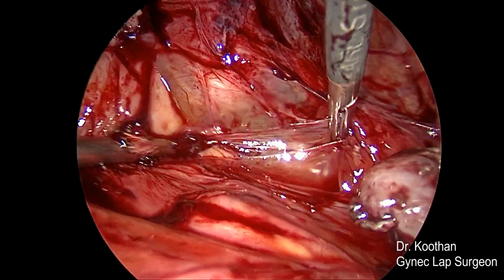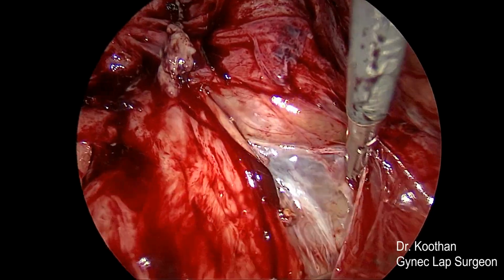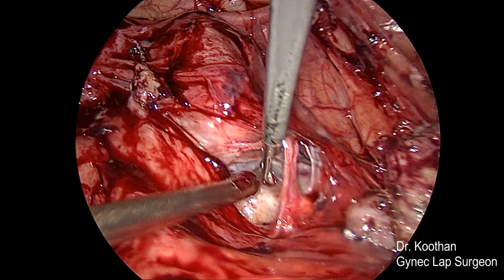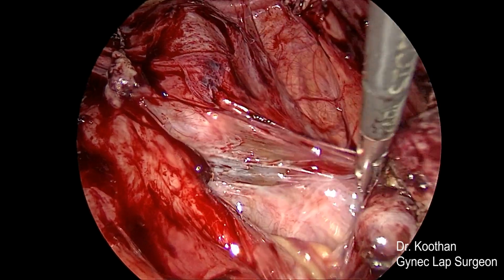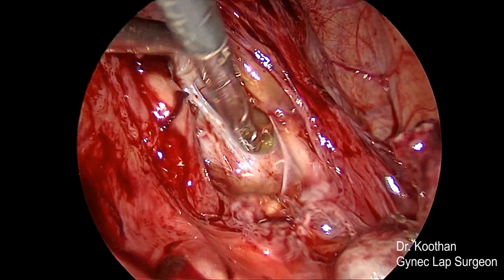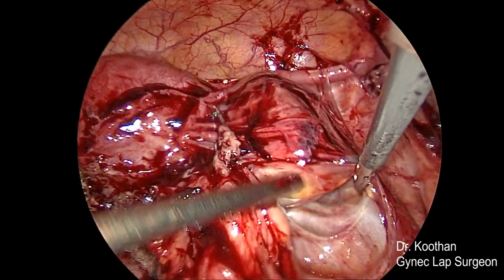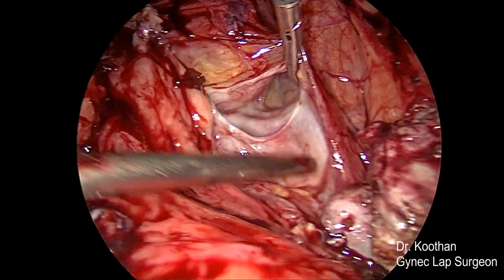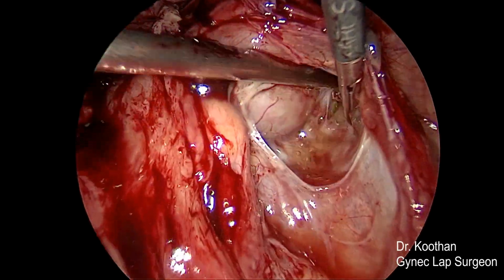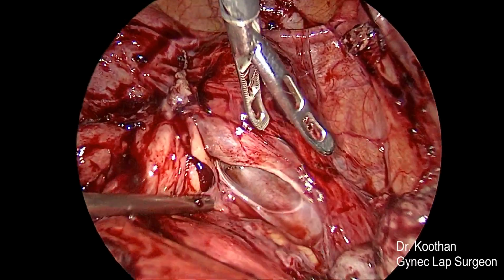We have started dissecting on the right side. So what you are seeing is the pararectal space basically. The dissection is between the right side mesorectum and the right side adnexa. So what you are seeing is the right infundibulopelvic, and the rectum is medialized, and the mass which you are seeing is the right side Pyosalpinx, which is densely adherent to the mesorectum.